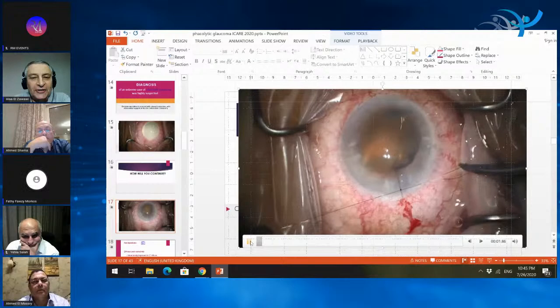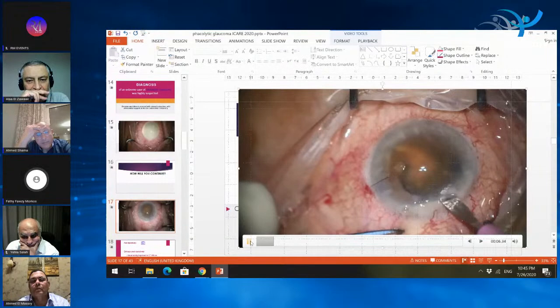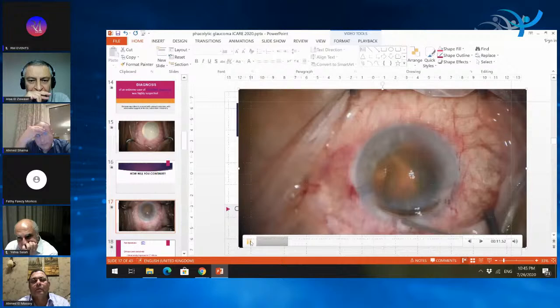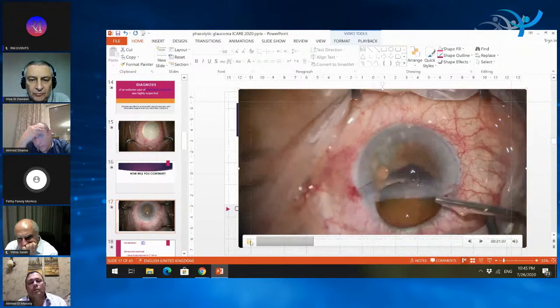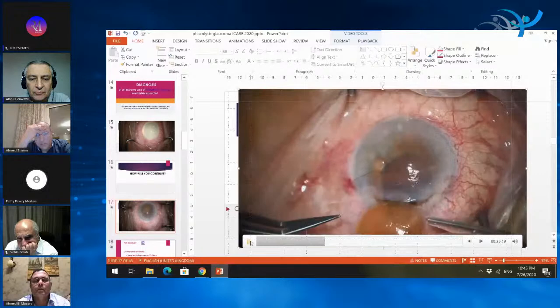Actually, I closed the wound and I shifted to the 12 o'clock position. I did a 5.5 millimeter incision and delivered this hard nucleus that really had no posterior support. I knew from the UBM that the posterior capsule had micro and macro defects. So I couldn't trust using phacoemulsification and losing the nucleus into the vitreous cavity. I did have some capsular remnants, but again, not reliable enough.